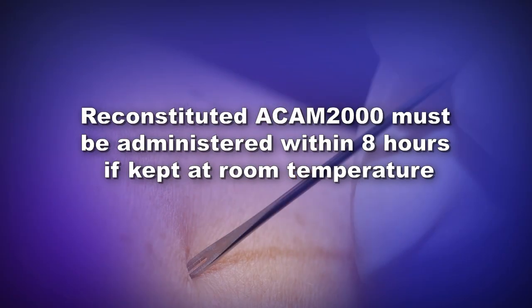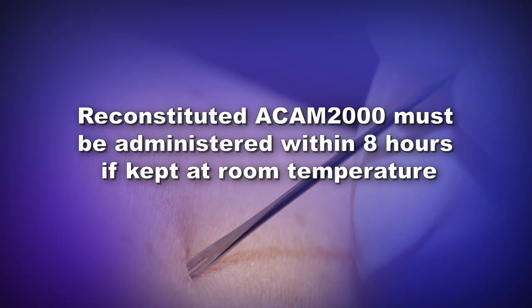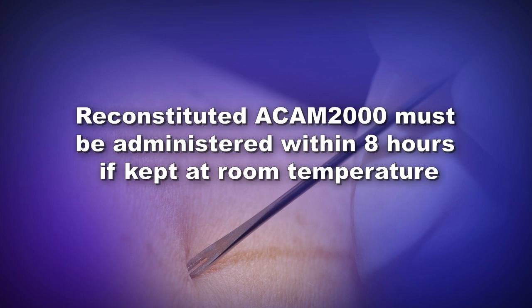Close the vaccine vial by reinserting the rubber stopper. Remember, after reconstitution, the vaccine must be administered within 8 hours if kept at room temperature.